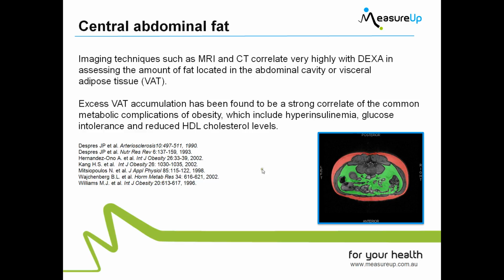One of the very important measures, particularly in the media these days, is that of central abdominal fat or visceral fat. And there are various imaging techniques such as MRI and computer tomography that correlate very highly with DEXA. One of the important things you need to know is that DEXA does not measure visceral fat. It estimates visceral fat. And that's the reason I have put one of my old slides here of some of the work I used to do with MRI.